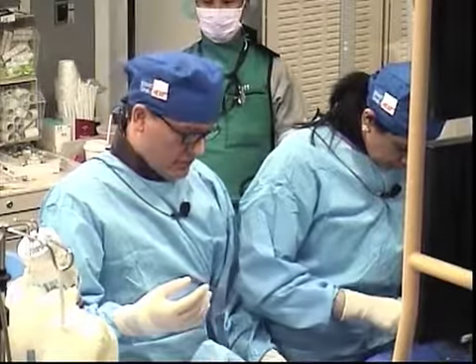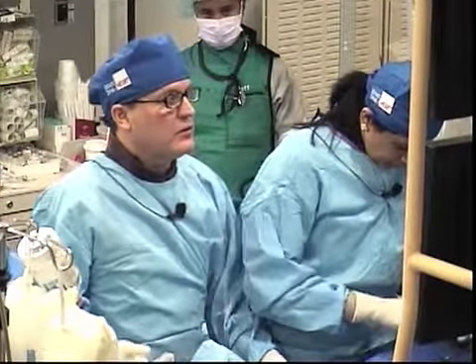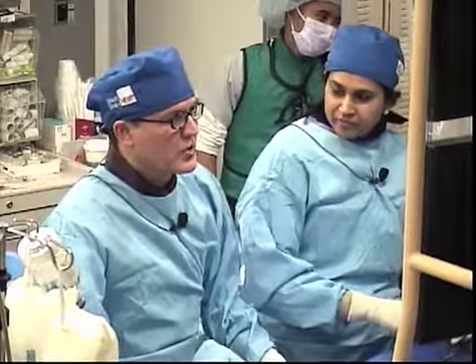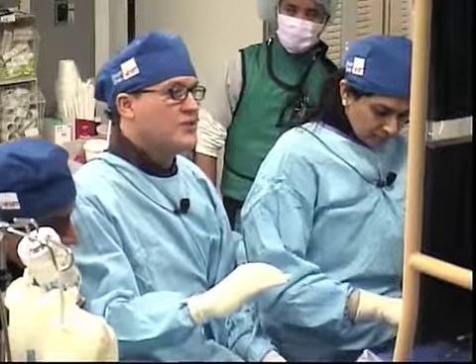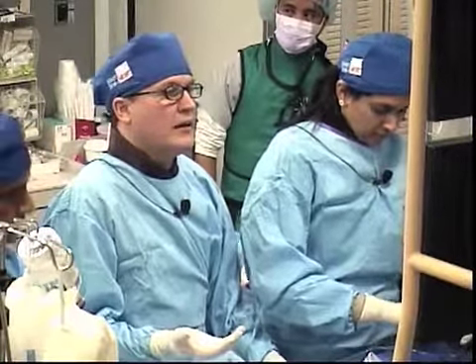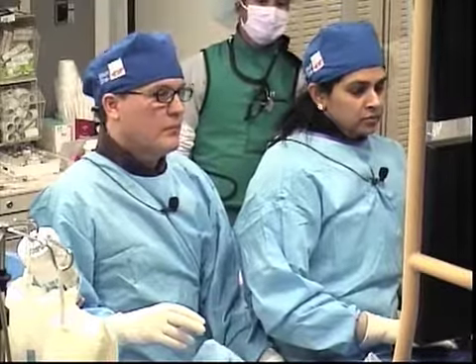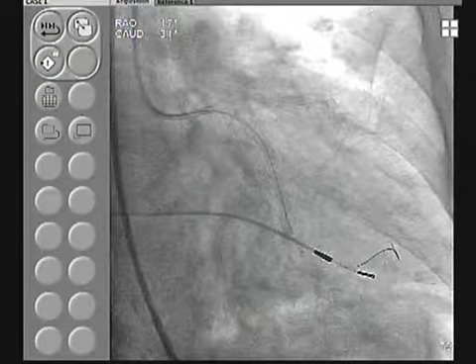Pedro, how many cases have you done with the OCT already? Yeah, we have done probably about 50 cases now. How much learning experience does one need? No, it's very fast. It is such an easy and clear-cut visualization of the vessel wall and the struts that the only issue we had to learn was when we do SKS, bifurcation, simultaneous kissing stents. OCT does not require a fifth year of interventional cardiology. No. All right, good to know that.